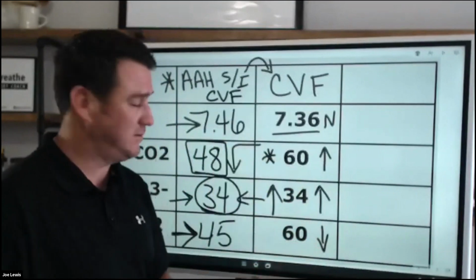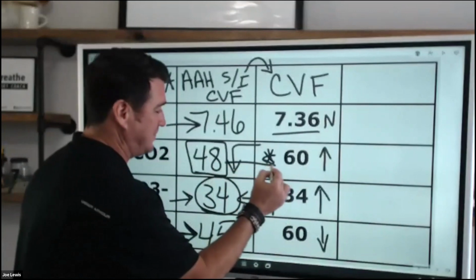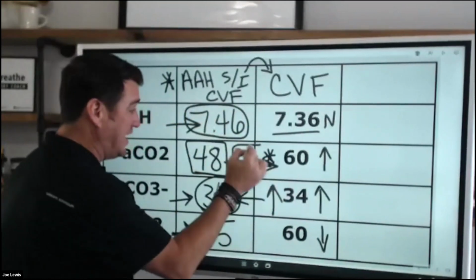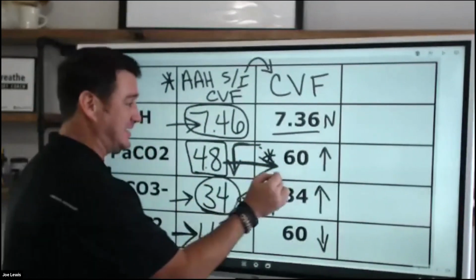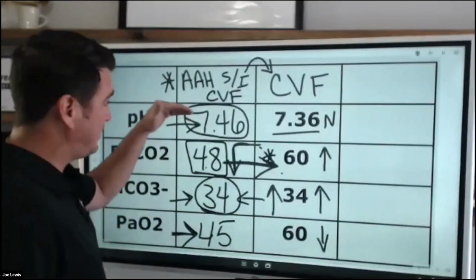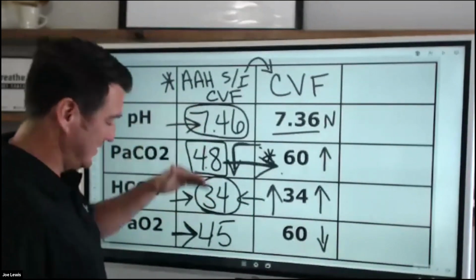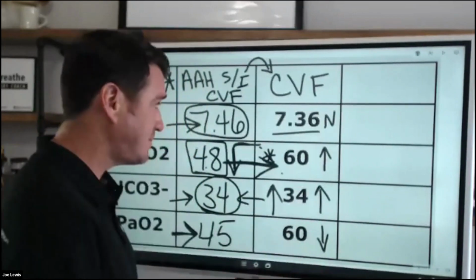You can't think like that, because you recognize, wait a second, we're alkalotic because we are less than our normal. So even though it's elevated, it's not for this patient. Okay, so keep that in mind when you see an alkalotic pH superimposed on an elevated bicarb. There's a good chance this is a chronic patient who is hyperventilating, okay?